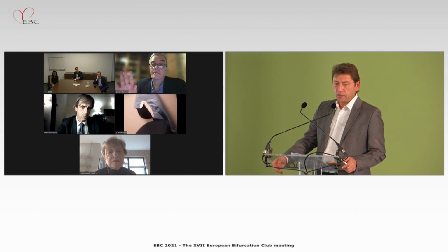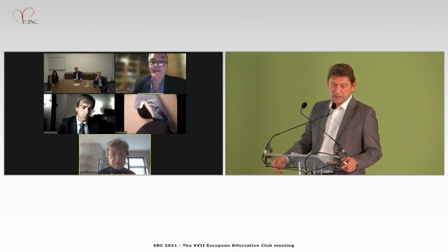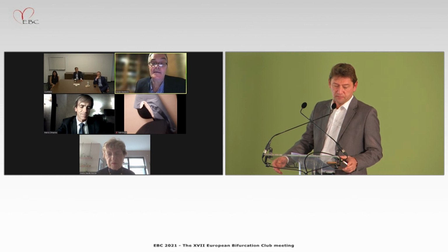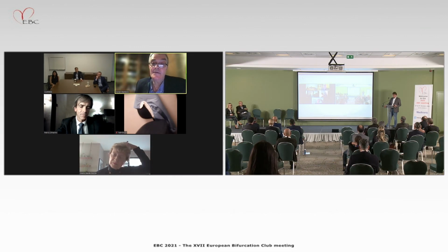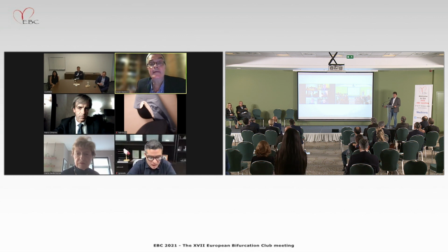So there seems to be, yeah, Goran wants to comment. Goran, yes. Thank you very much, Marie-Claude. Actually, it's more a question for Marco Zimarino and maybe George Dangas, because in our consensus document on antithrombotic treatment in bifurcation PCI, we discussed the role, and the algorithm contains the role of imaging and should help us determine maybe the length of DAPT based on use of imaging and probably optimization of the procedural result.